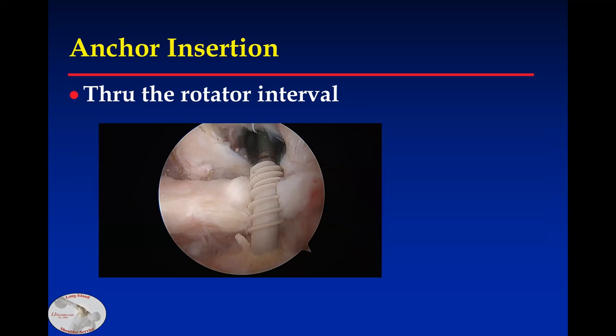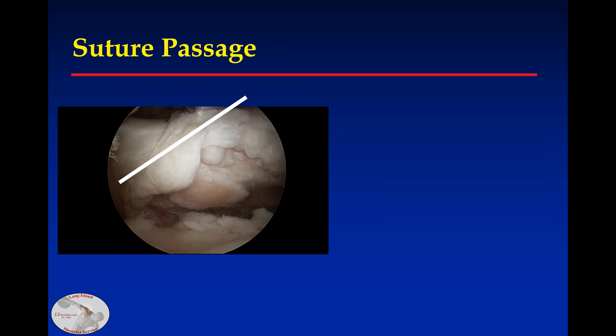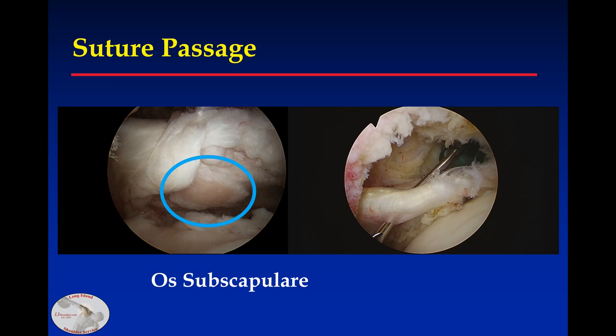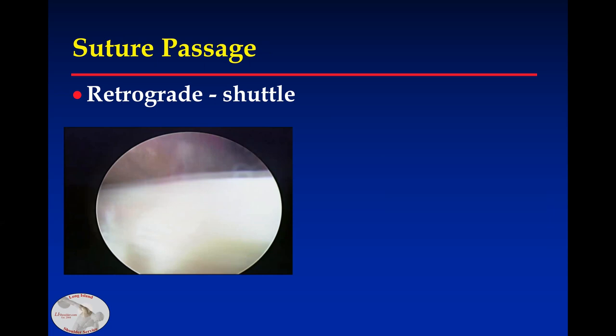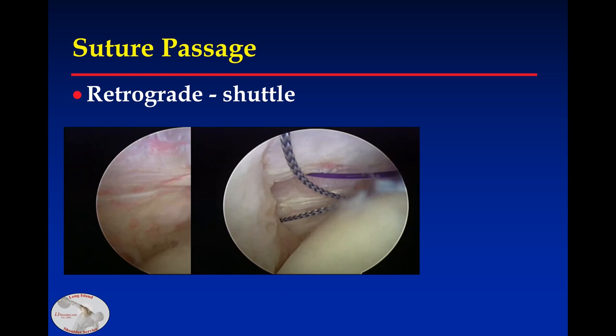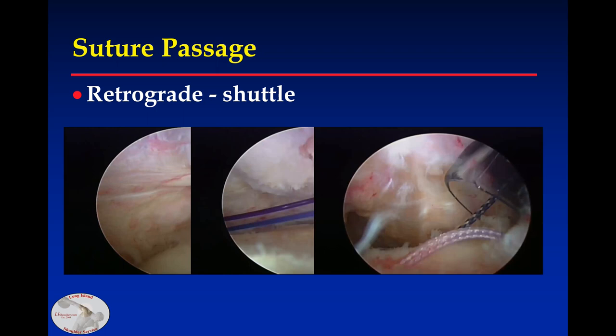For suture passage, I like a retrograde technique because the tendon fibers run along this line, and I want to pass sutures similar to that line. As an aside, this is what I've termed the os subscapulare, and when you see it on preoperative imaging, in my cases it has always indicated a subscapularis tear. For the retrograde technique, I'll bring the crescent-shaped hook about two centimeters inferior to the rolled edge and about a centimeter and a half medial on the subscapularis. I'll bring that shuttle suture and pass my repair suture through. I'll bring all sutures for each anchor through, then tie them.